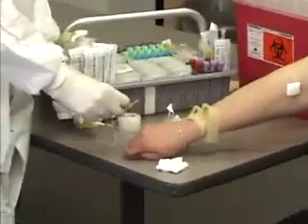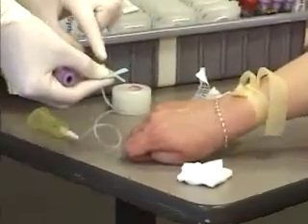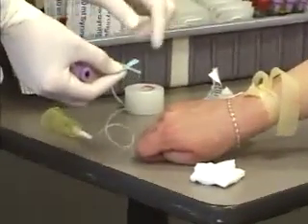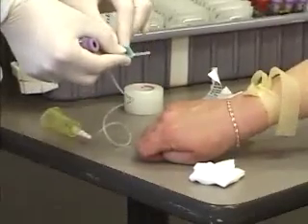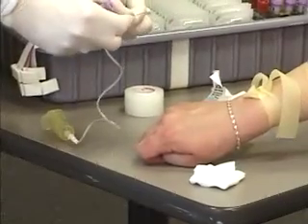We're going to take our butterfly and take off the cap. This is a safety butterfly, so this yellow device is actually the safety part that we will not use until the very end. You want to pinch up your wings, take the top off, and once again, we want to make sure we have our bevel up.